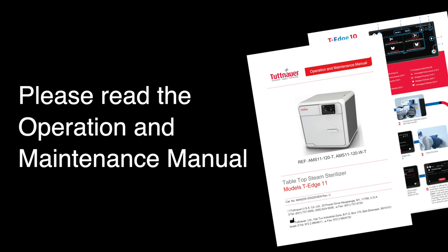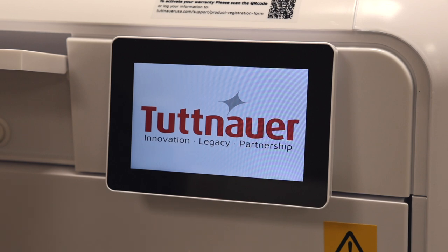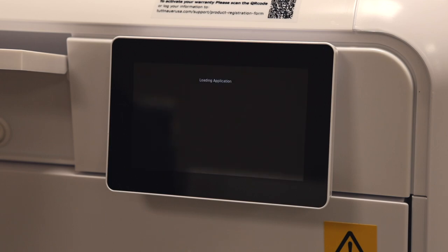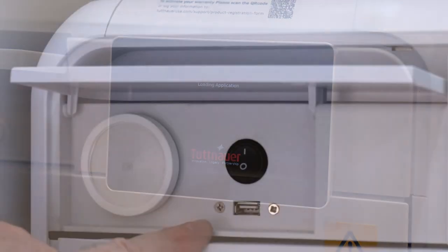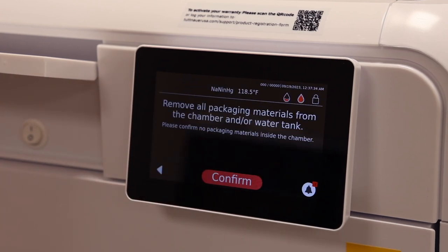Now that the machine has been placed on the countertop and plugged into a 115-volt dedicated 15-amp circuit, with the semi-automatic power switch in the back left turned on and the primary power switch in the front also turned on for the very first time, you will see a setup screen. It will ask what language you would like — we'll pick English and hit Set.